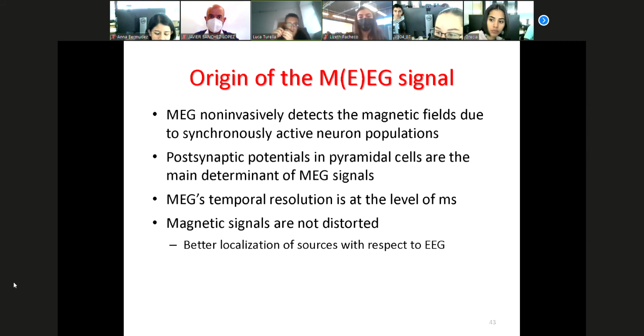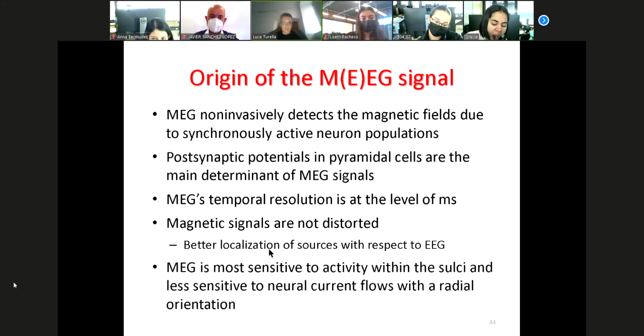That is basically generating the signal might not actually be true. So when we do a simulation of source analysis, we know exactly the data we are creating. We generate one activity in the brain, and then we make a simulation to pretend that we are recording that signal from the sensor, and then we can go back from the sensor to the brain, and we should see the same stuff. In this case, we know the ground truth. And if you do the same type of approach with EEG and MEG, normally MEG is much better than EEG, especially if you don't have, for EEG, the anatomy of a participant, and you use a very complex type of model in order to go into source space.